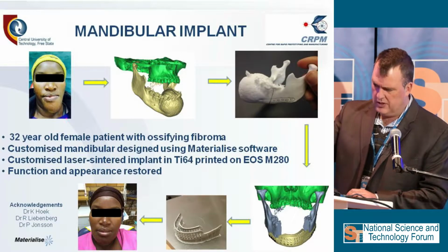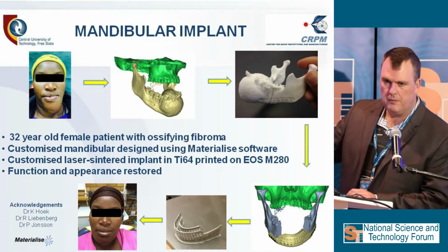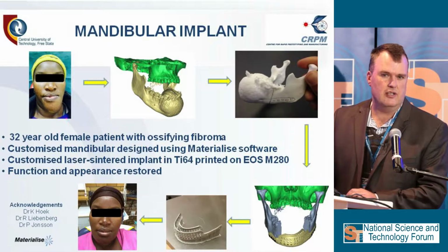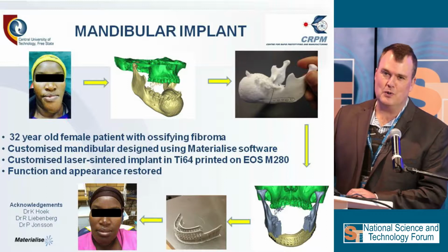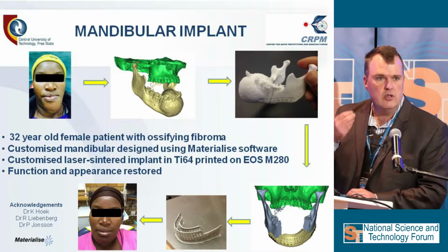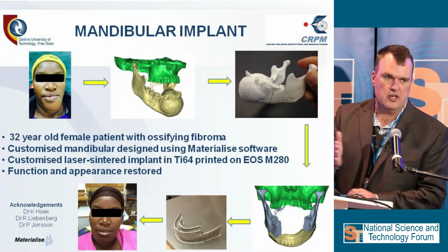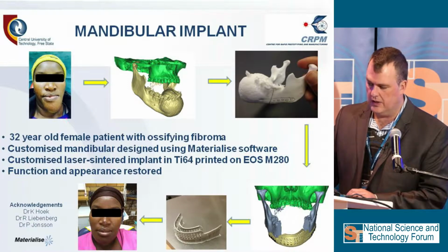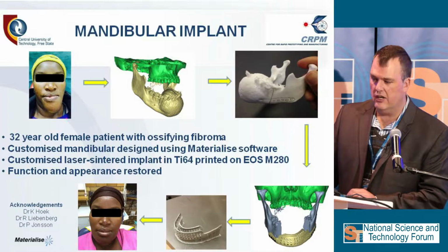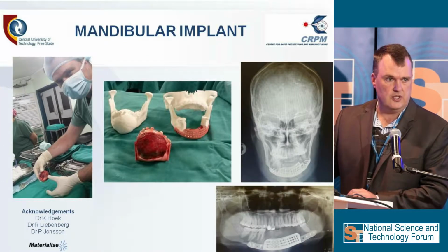So we will go from the CT scan, pre-op model, design. On the pre-op model, and in the future we will have online planning software. And that's a standalone, so you don't need to buy all the implants from Stryker if you use their software. But the doctor can indicate where he wants to cut, where he wants to have a resection line. So all of that will be done electronically. And then the next slide is now in theater. So that's the size of the tumor with a cutting guide that was 3D printed.